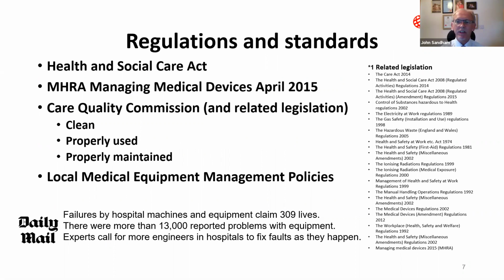Historically, there have been many serious injuries and deaths involving medical equipment failures and misuse. I read that approximately 5,000 people are seriously harmed each year and over 300 die due to adverse incidents involving medical devices. To counter the risks to patients, politicians have introduced many regulations and standards. These regulations and standards are intended to focus the minds of the senior management on good governance, but there is also an opportunity here to promote the use of new technology with the trust executives to reduce risk and improve clinical decision making, thereby also assisting with the governance.